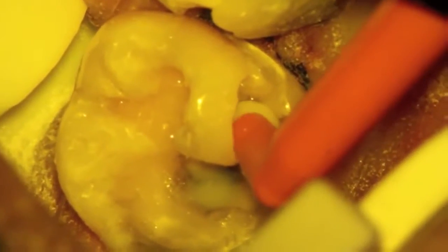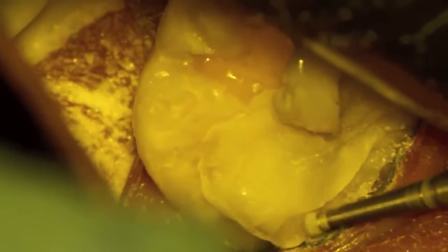This is the Ketac Nano, which is placed over the tooth area, and it's just kind of like cement in the sense of placement. We light cure it, and now I'm coming back and polishing up the edges and getting the filling ready to receive the final harder restoration of composite.